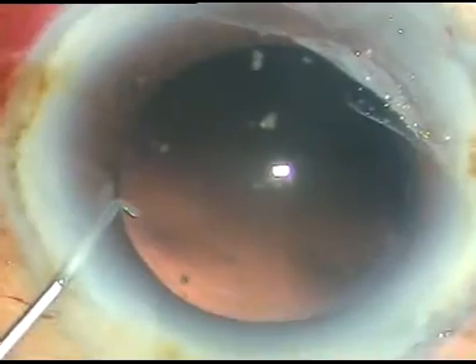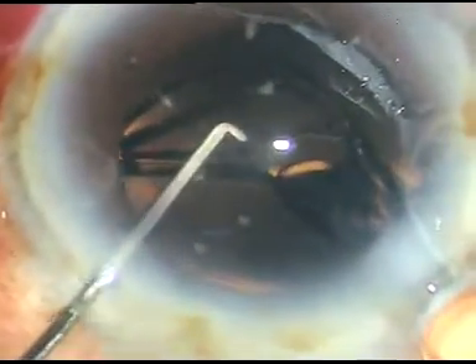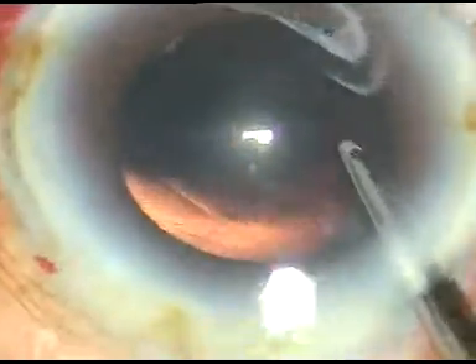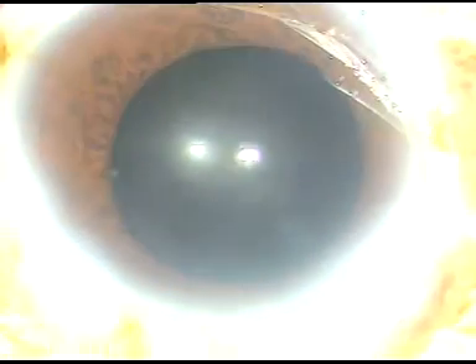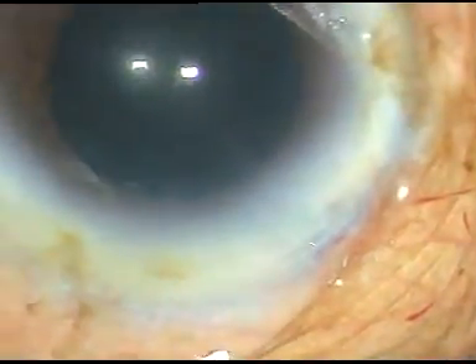See the beauty of the Oatley Cataract 3 phaco tip — the wound is clear, there is no wound burn. After cortical clean-up, a foldable intraocular lens is being implanted in the capsular bag. The leading haptic has gone into the bag and the trailing haptic has also gone into the capsular bag. The cleaning of viscoelastic substance is done thoroughly using a Simcoe cannula as well as bimanual irrigation-aspiration. After thorough clean-up of the viscoelastic substance, the side ports are hydrated and the anterior chamber is formed. See the main wound — there is no wound burn. Thank you very much for watching. Hope this video will encourage you to do hard cataracts with mid-range phacoemulsification.